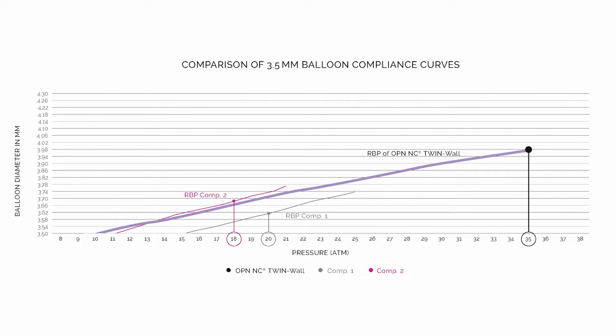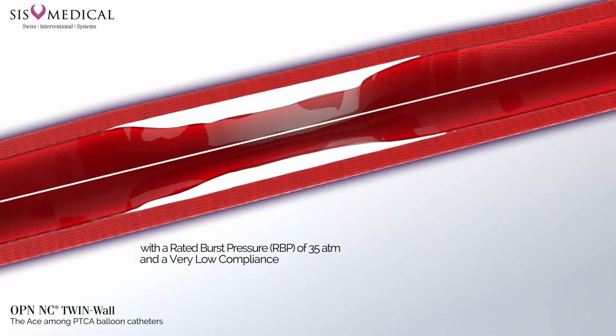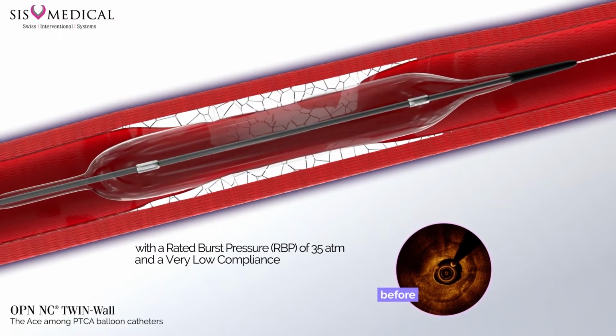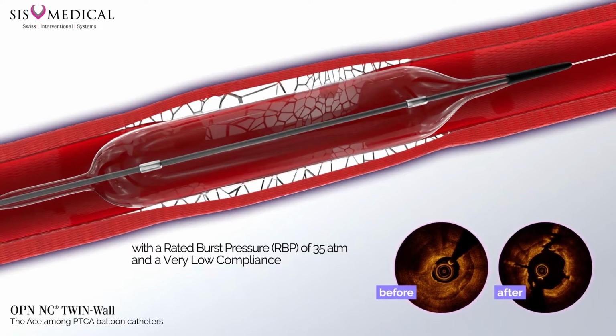And as I have said many times, and I believe this is really an important message for all, vessels are ruptured by diameter, not by pressure. So in my opinion, one should use an OPN NC balloon, because this is the only balloon where you can go to relatively high pressure without really risking the vessel to be ruptured, because your diameter will not increase exponentially.